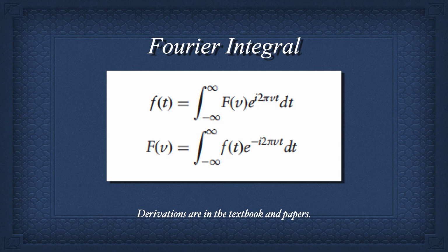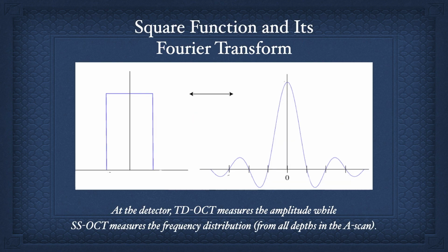For a given amplitude, we can take the Fourier transform of the amplitude, and it'll tell us what frequencies are in that configuration. I know that's a little bit confusing, and this is derived out in the first 4 chapters of the textbook and hopefully made much simpler.